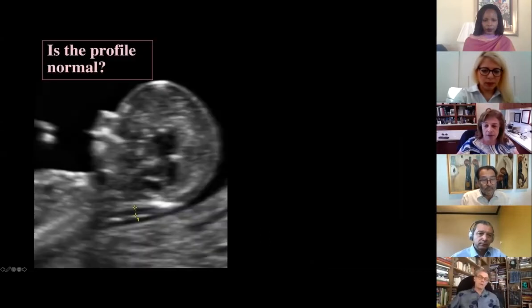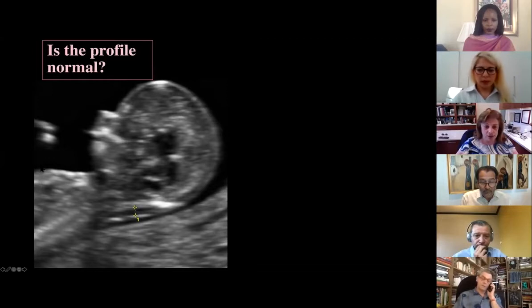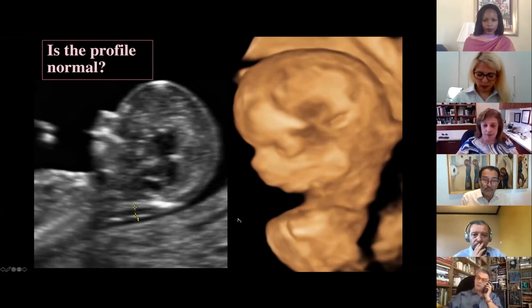But you can see that the chin is abnormal. And again, these patients all come in to get their nuchal translucencies or their first trimester evaluation, and this is a perfect time to look at the chin. Now, I tend not to measure as much as many other people. I will look at it, and if it looks funny to me, I will look into it further. But you can see that 3D makes it even more obvious that there is a problem with the chin here.